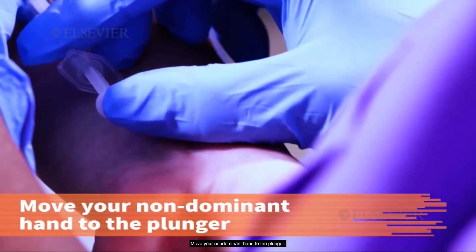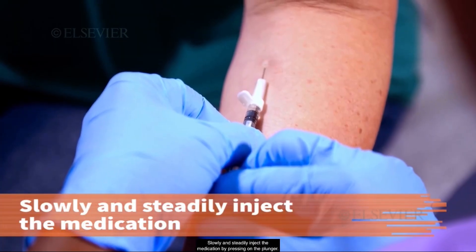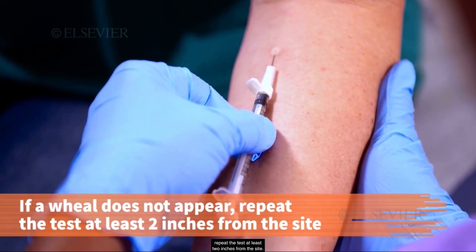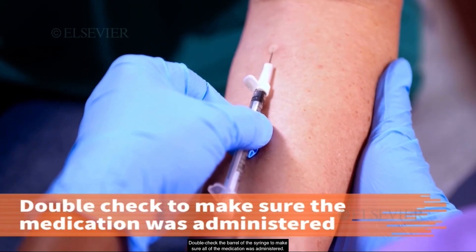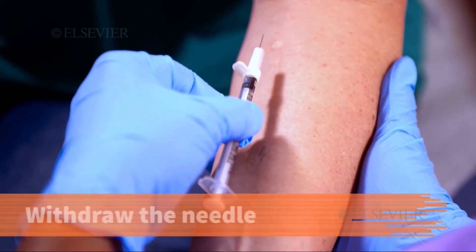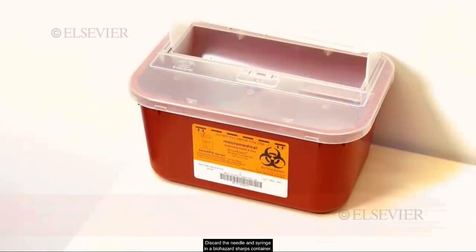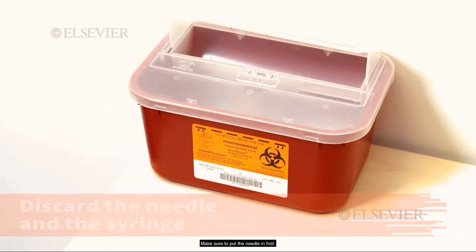Move your non-dominant hand to the plunger. Slowly and steadily inject the medication by pressing on the plunger. If a 6 to 10 millimeter wheal does not appear, repeat the test at least two inches from the site. Double-check the barrel of the syringe to make sure all of the medication was administered. Withdraw the needle. Activate the needle's safety device with one hand. Discard the needle and syringe in a biohazard sharps container, making sure to put the needle in first.